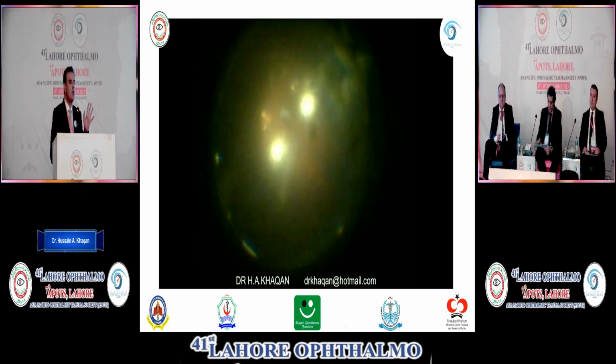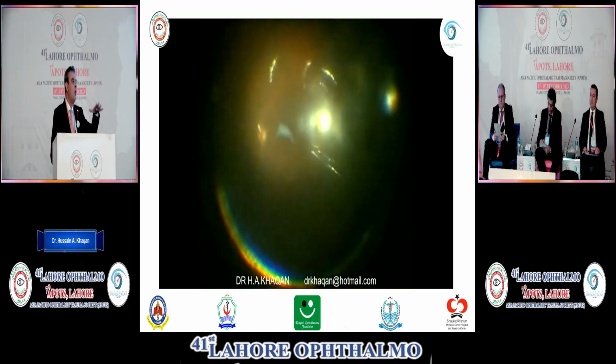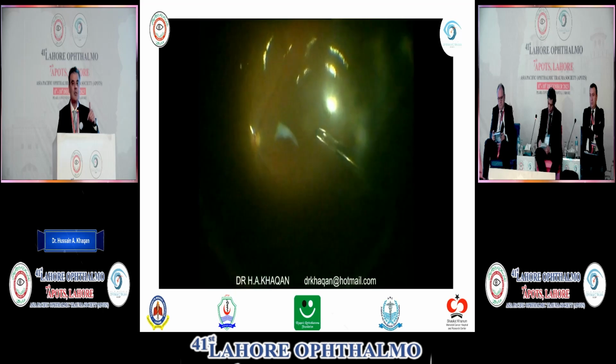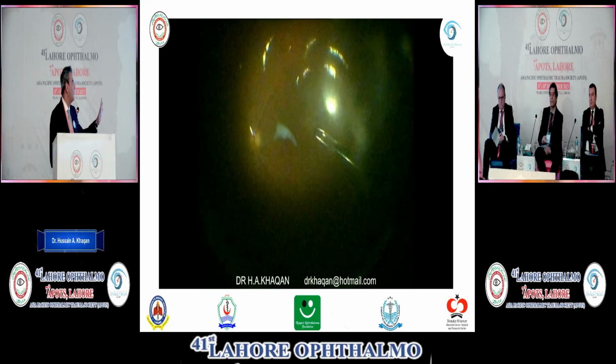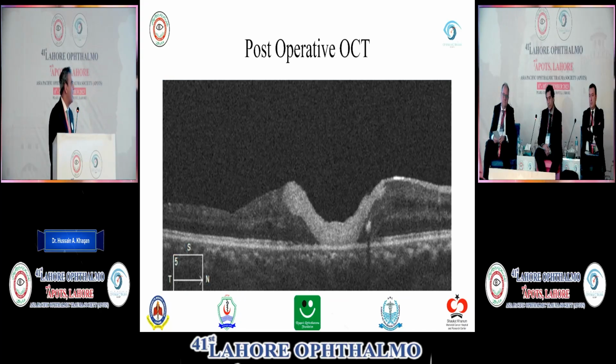Yes. So we give just a scaffold of amniotic membrane over the hole. This concept is now more popular in primary macular hole surgery, when people talk about the temporal flap, just giving a scaffold over the macular hole. So here I just gave the scaffold and just left it. Here you can see the post-operative. This is type 2 closure, but it is very precise.